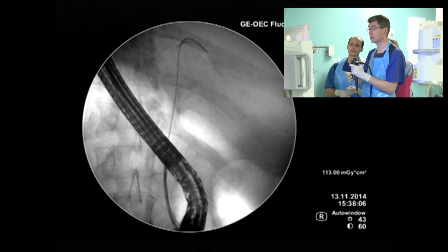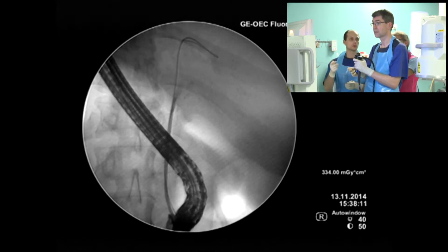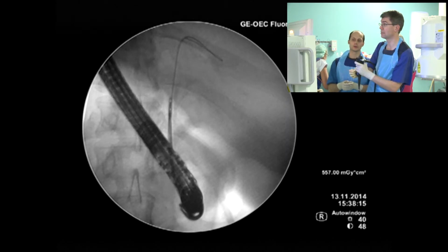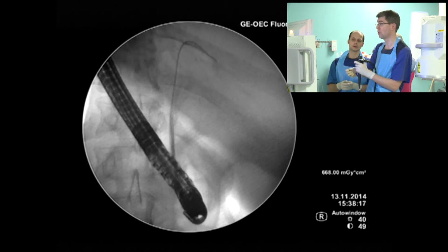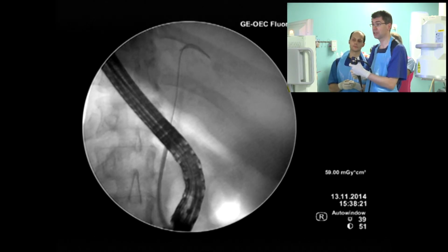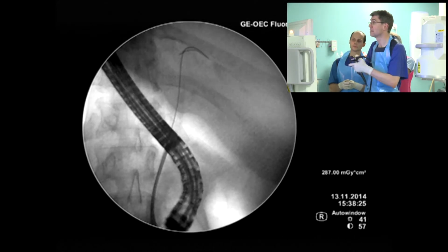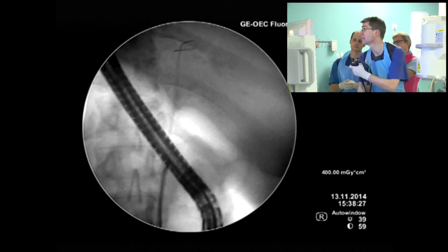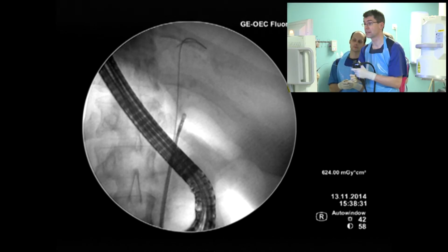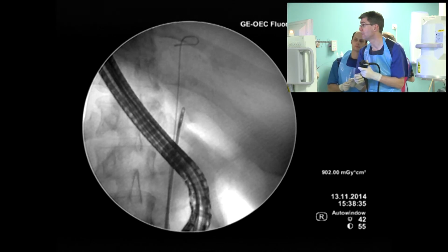Yes, but in any case, the next option is we try to perform a FNA of lymph nodes here. Yeah, that's now after this procedure. Anyhow, I just try maybe once or twice more, and if this doesn't work, you can always take a brush cytology out of the hilum, of course, because the brush is wire guided. Different to the forceps here. I just try it for maybe once or twice. And if it doesn't work, we go for FNA of the lymph node.